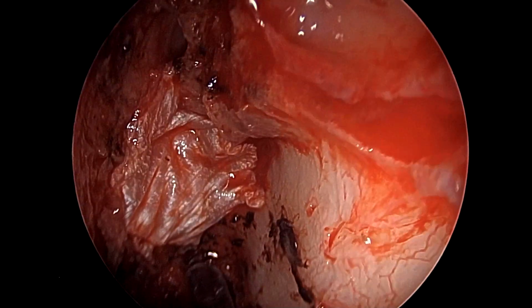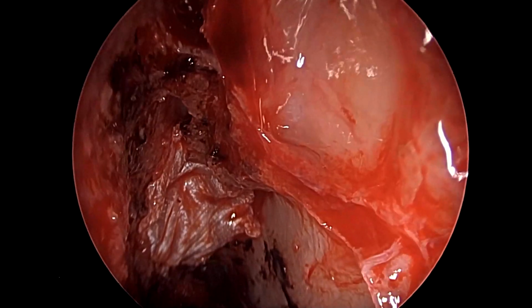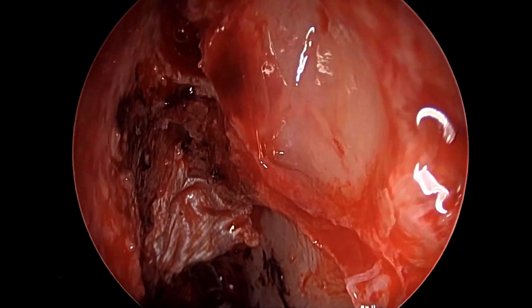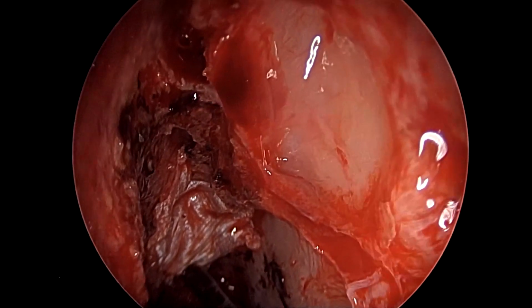Now, fascia requires bare bone for adherence. It does not adhere to mucosa. Hence, it was imperative that all mucosa be removed from much more around the size of the defect for this fascia graft to be taken up.